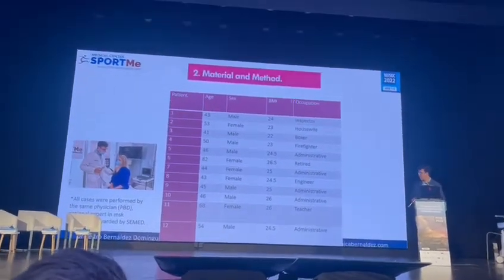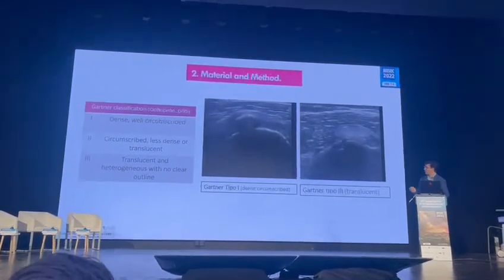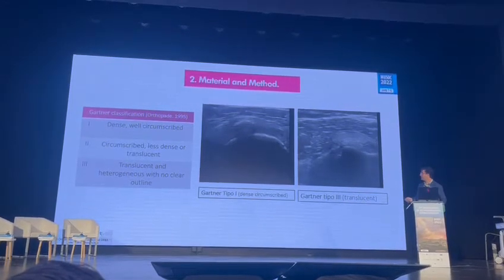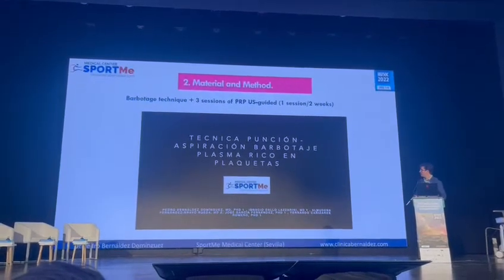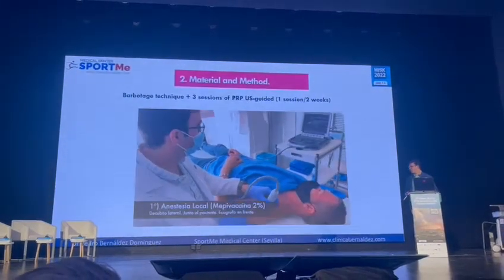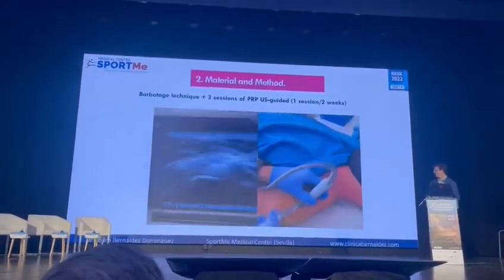All the cases were performed by the same physician. And the Gartner classification, 1, 2, and 3, depends on the density of the calcification. This is the technique that we do, the technique of puncture, aspiration, barbotage, used with PRP. We put 2 milliliters of lidocaine, 2%, the anesthetic.